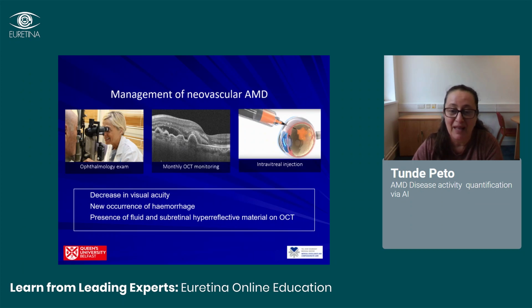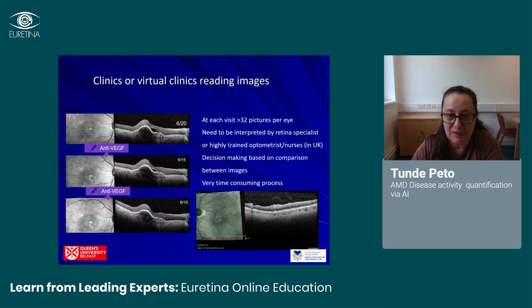Marion has alluded to some of these strategies, but we are going to discuss some more. We have been working very closely with Tel Aviv to look at the images that we have for AMD and how we might be able to use them better. If you think about it, we take a lot of images for each eye. This is then interpreted by either a retina specialist or, in the UK, a lot of the time by highly trained optometrists or nurses. The decision making is based also on comparison between images.